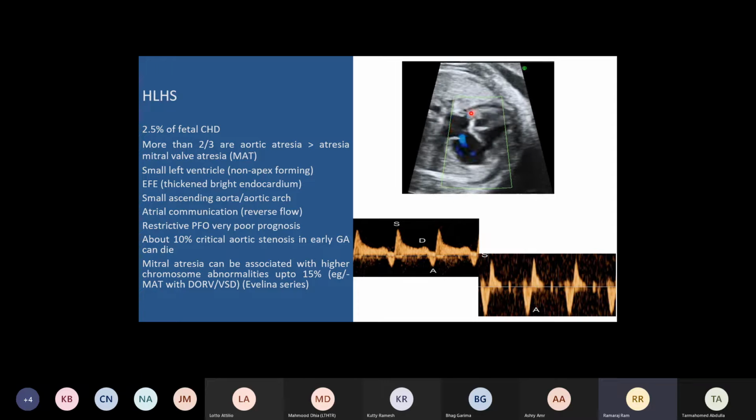diagnosis of hypoplastic left heart, it's important to assess the forward flow, aortic valve movement, if the aortic valve is still showing forward flow, and try and get the size of the aortic valve. And on the 4-chamber view, it's important to assess. In this particular example, you could see the PFO is restrictive, and it's a continuous flow from left to right, and the LA is getting prominent.